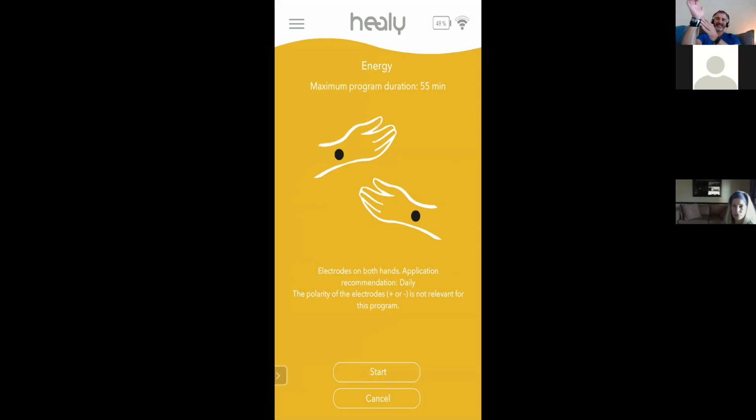So I can use sticky pads, like say, for example, if you got your device and the wristbands were back ordered due to weird COVID issues, and they didn't send you wristbands, but they sent you some sticky electrodes. Awesome. You could stick the sticky electrodes on your wrist, like right here, or on the back, okay?